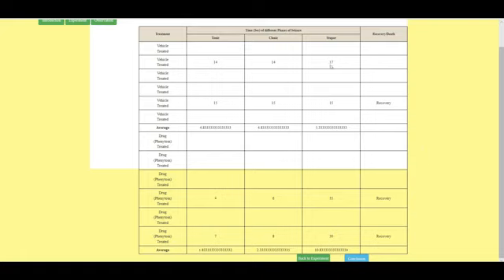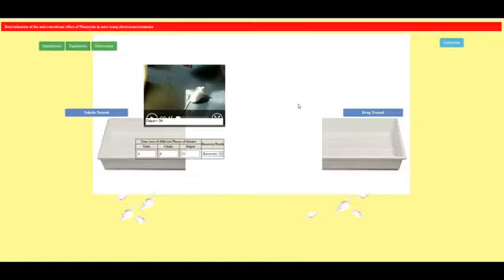Dear students, I hope this experiment has made you understand the effect of the anticonvulsant drug, how the shock has been induced on the ear pinna, and how the drug PHENYTOIN has been administered. I hope this experiment will help you in doing your assignments, the pre-test and the critical thinking questions. For any doubts and queries, please feel free to ask. Thank you once again.